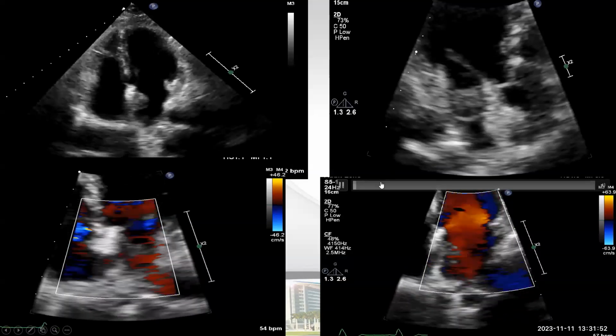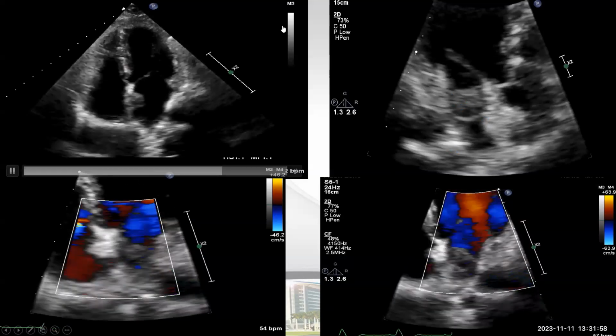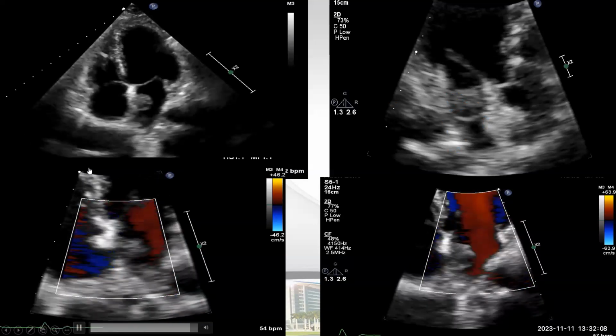I will show you here. It's not working, unfortunately. It should be by a peduncle. Pedunculated and attached to the septum. Heterogeneous, yes. What else? There is something here you can see. By color, what do you observe?